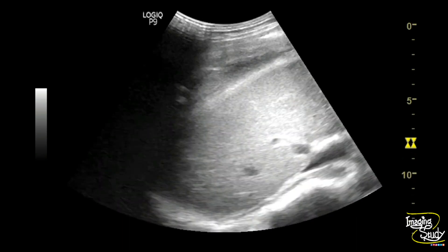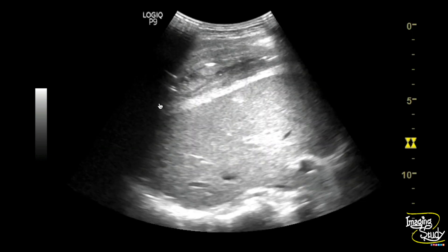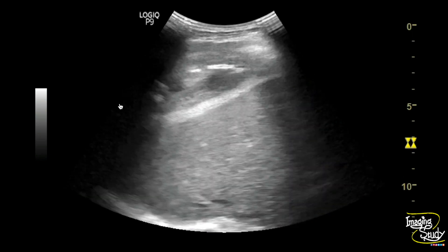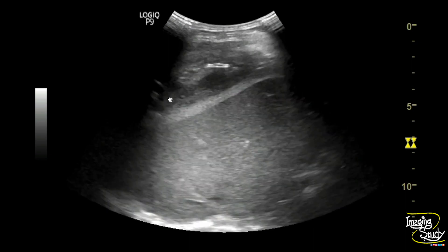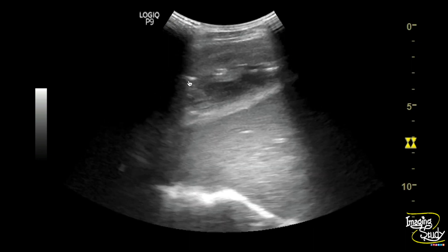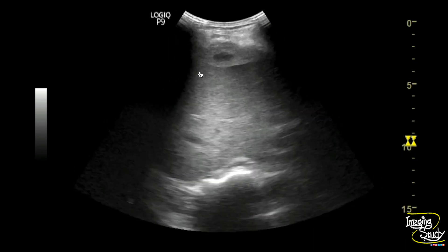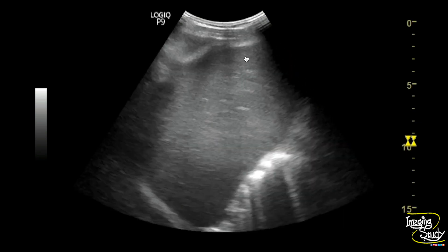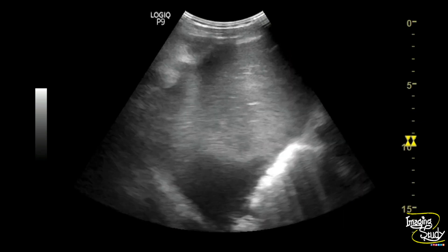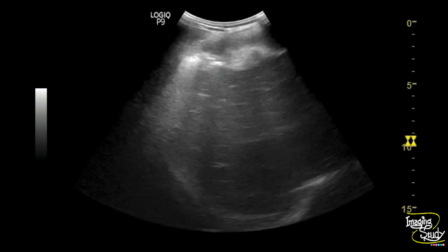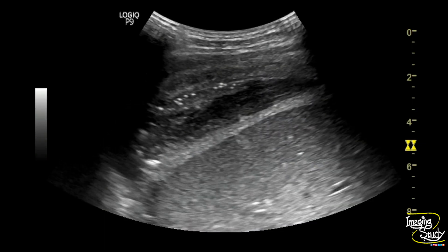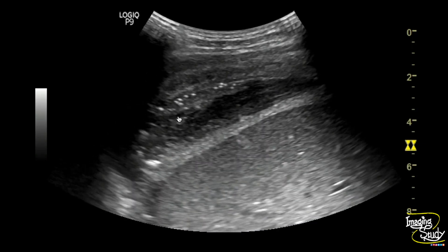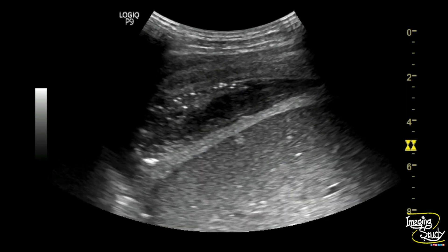This complex area is the sub-diaphragmatic abscess. Here is another view — you can see this sub-diaphragmatic abscess assessed from the right subcostal region. These echogenic foci are air droplets. You may miss it when you are evaluating the liver. Here is the magnified view and you can see the thick-walled complex area that is the sub-diaphragmatic abscess.